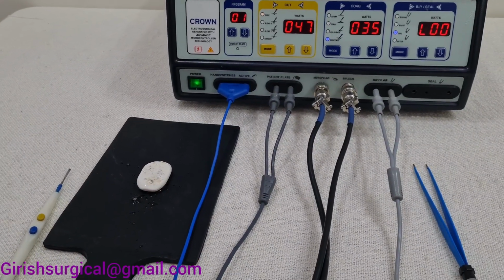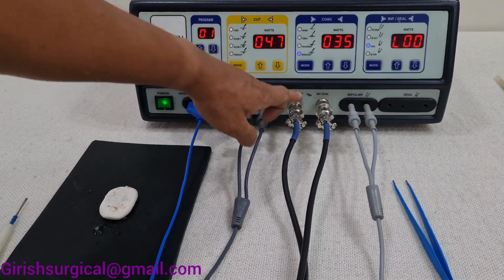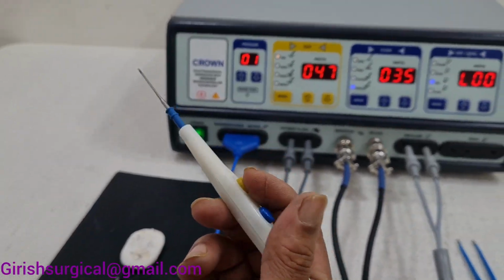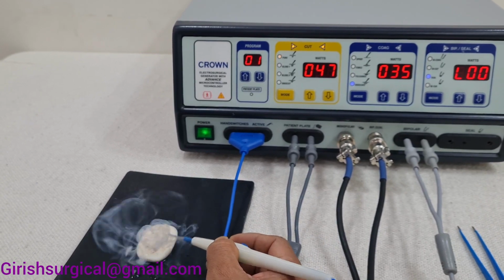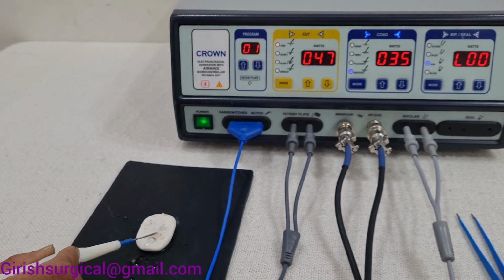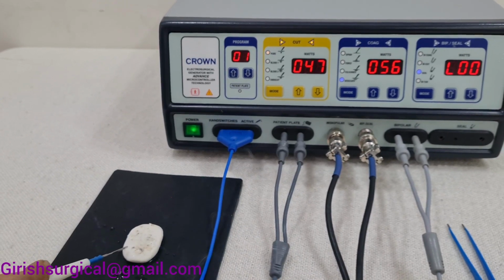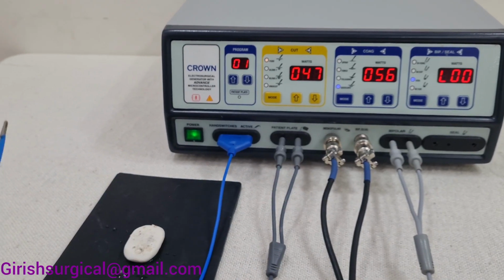Here all the accessories are attached according to the features, whatever is there, meaning the active handle, patient plate, monopolar foot switch, bipolar foot switch, bipolar. So we'll check it with the hand switch pencil. The cutting, and this is coagulation. If you increase the intensity, this is hand switch. Now we'll see the bipolar one.